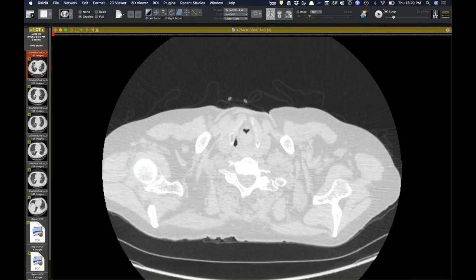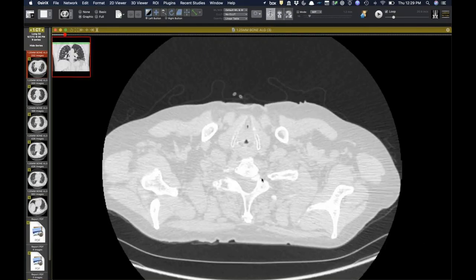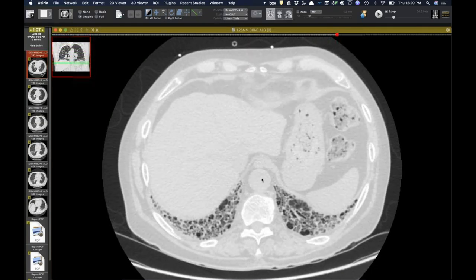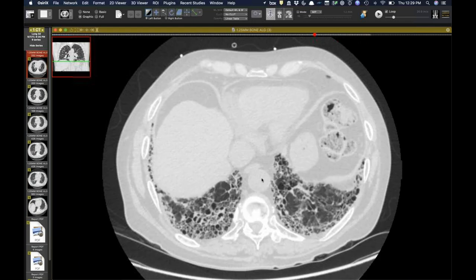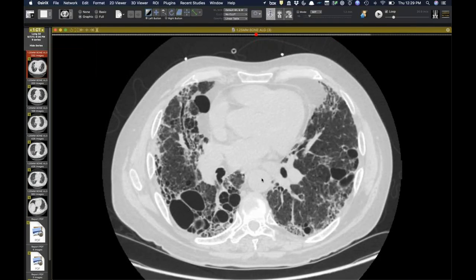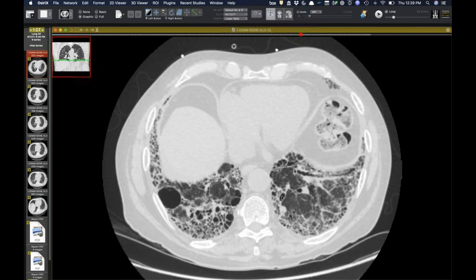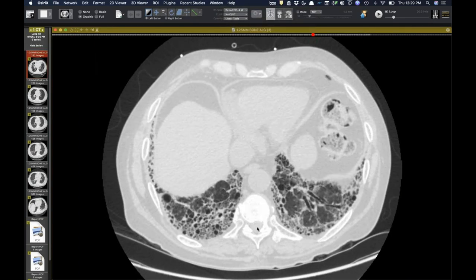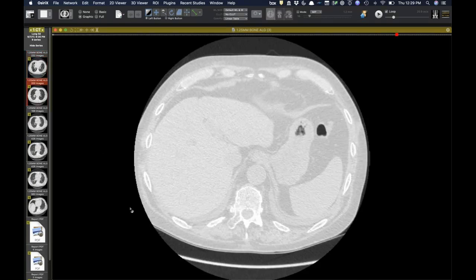This is kind of an interesting case — I'm curious if anyone has encountered this before. This is a man who has a UIP pattern — some of these cysts are big — and he was diagnosed with idiopathic pulmonary fibrosis and transplanted almost two years prior to his acute illness. The pathology was consistent with UIP.